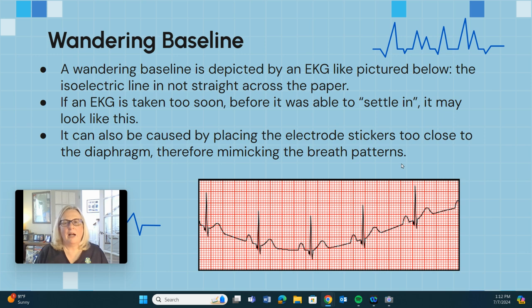Okay. So the other thing that occasionally happens is the stickers aren't laying flat. So you could get this by them not laying flat as well. All those things you can fix. Again, if you need to review anything or pause at any time, do so, and go back and get your notes filled in. We're going to do some review now. You do have the review in your packet, so we're going to take some more notes in our packet on the review.